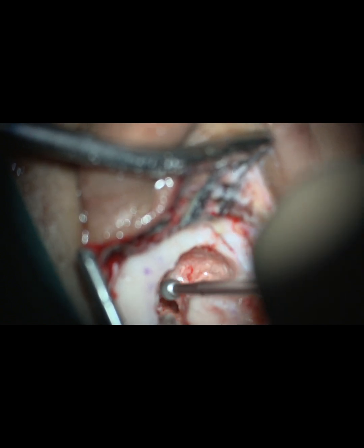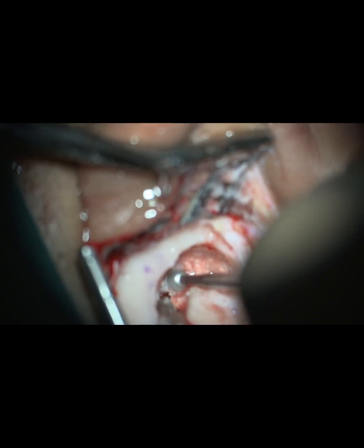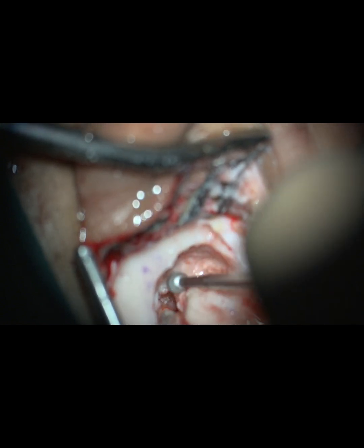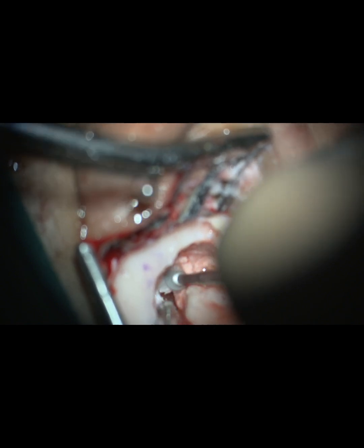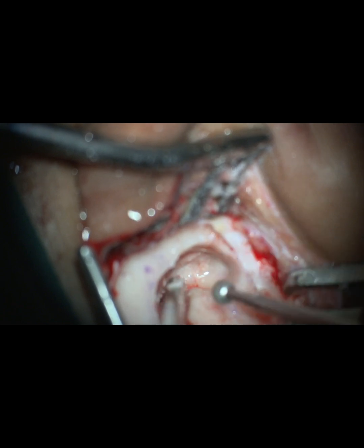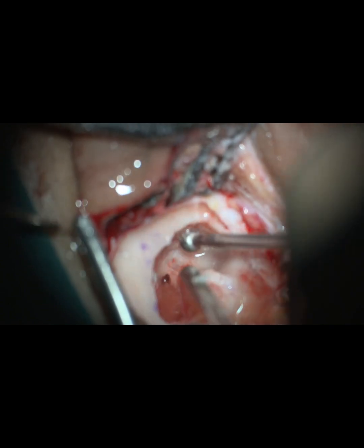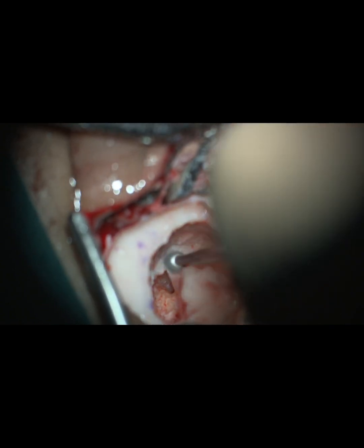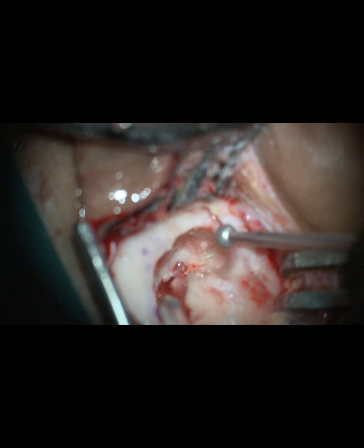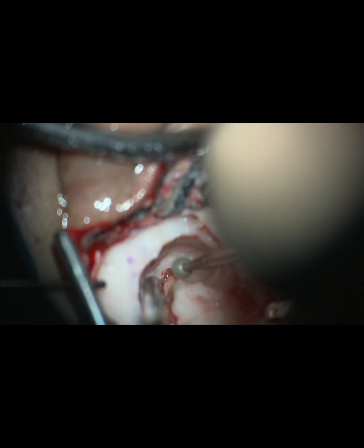The patient had grade 2 microtia also, but it was completely asymptomatic or not bothering to the patient or the parents. See, now as we open the middle ear, more and more picture of ossicular chain status is getting clearer. The middle ear was small in size with no evidence of tympanic membrane.